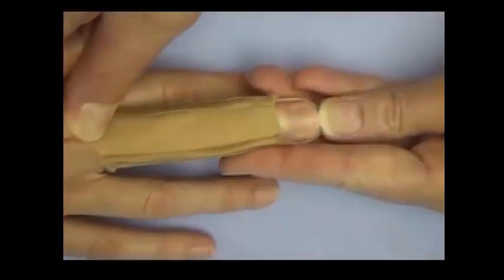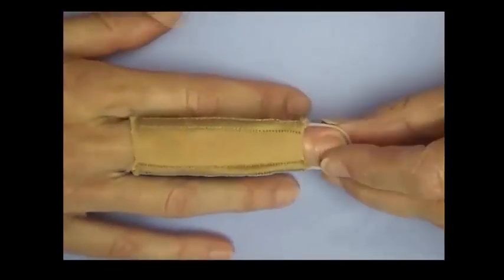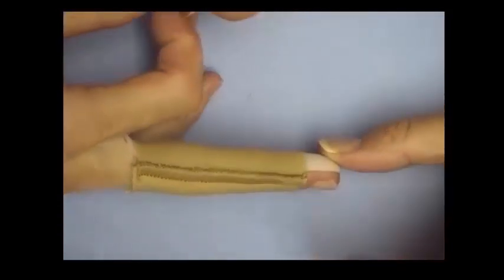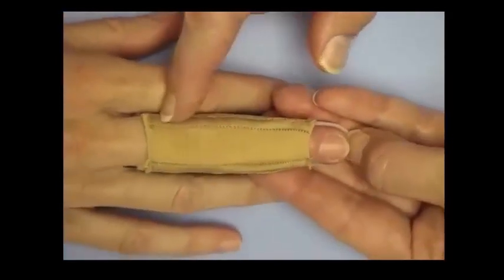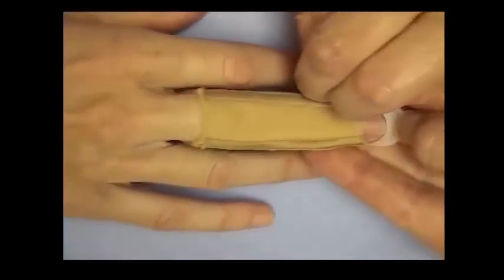Alternatively, an elastic sleeve can fit over the entire orthosis and again provide an easy way to apply and remove it, especially if the orthosis is worn intermittently.